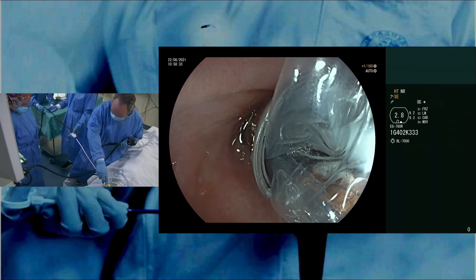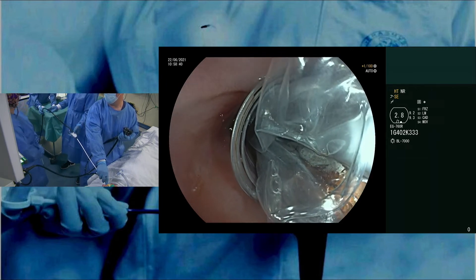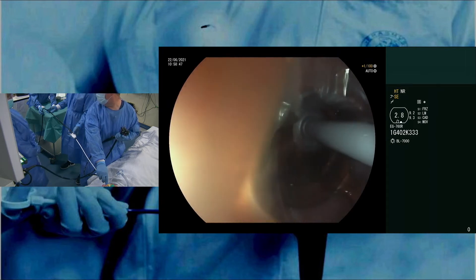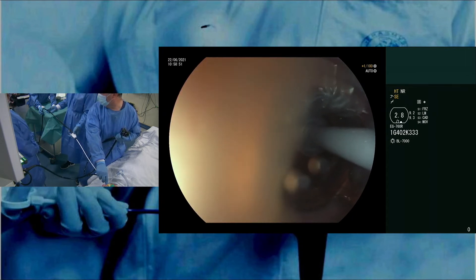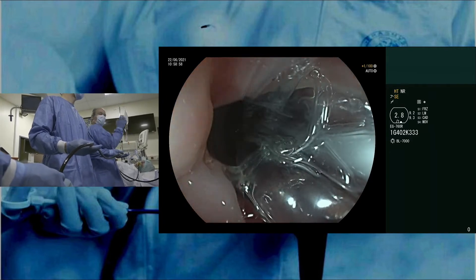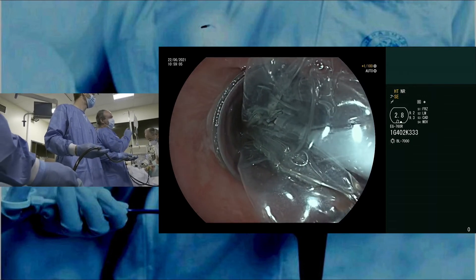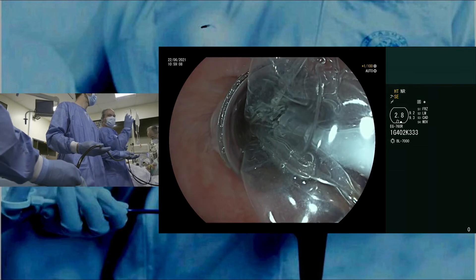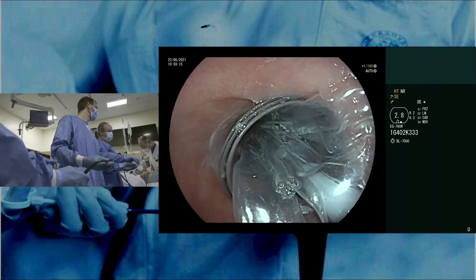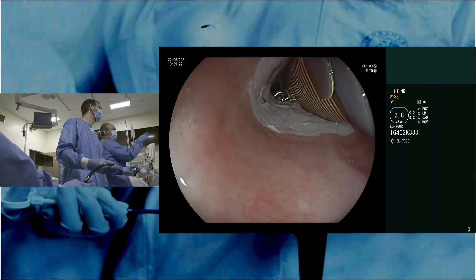We switch on the balloon insufflation by hitting the grey paddle. You see it automatically inflates and you will only have a small size indicated at 18 millimeters. We push the blue paddle and immediately all the energy is delivered. An important issue — sometimes the balloon doesn't really desufflate, and then you need to really turn the system clockwise, always clockwise, to reshape the balloon over the catheter and be able to insert it more distally.